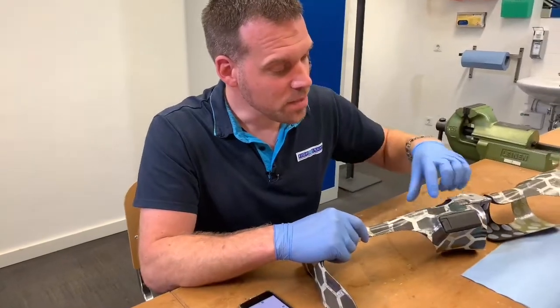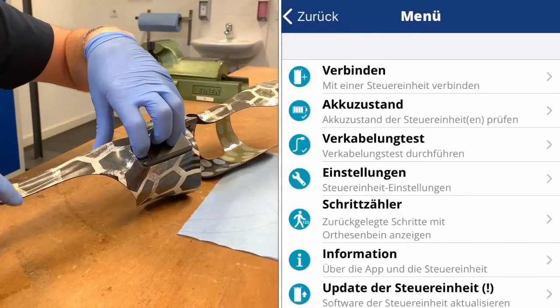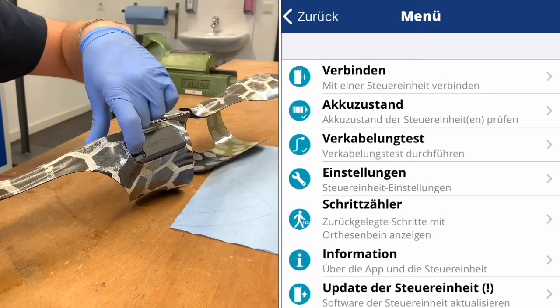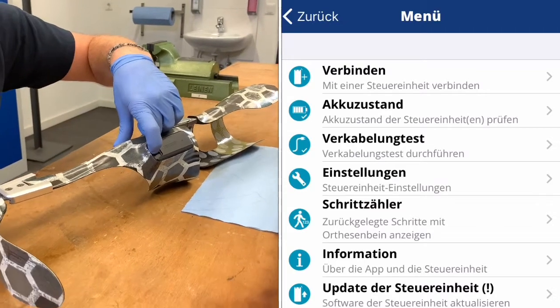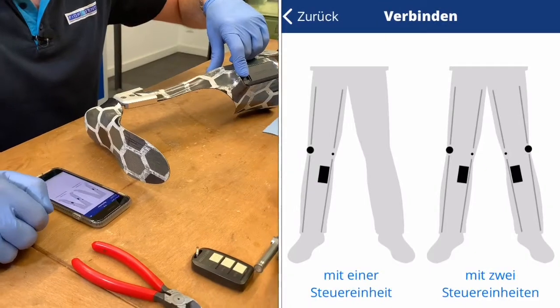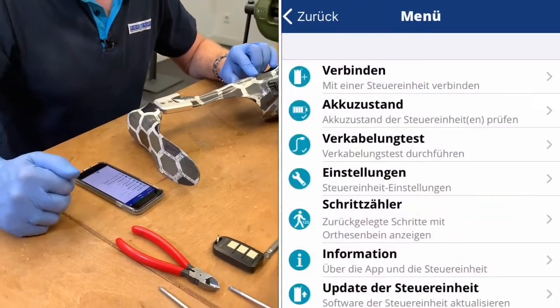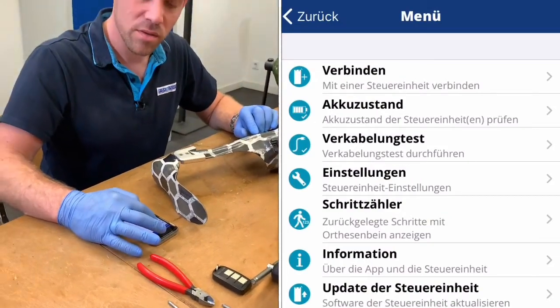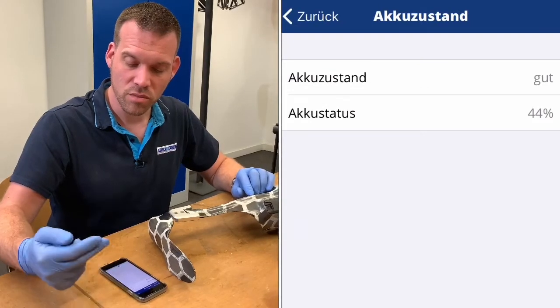Before we go ahead with taking the joint apart, we check the condition of the electronic components. To do this, we connect the controller to the multipurpose device or to the expert app. This is done by pressing the mode button for 6 to 10 seconds. We make the connection, then check the battery status — in this case it is good, at 44%.